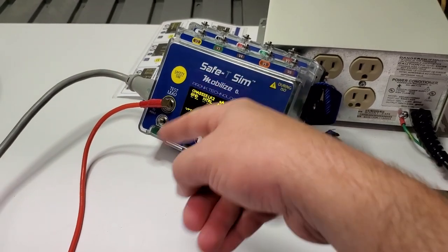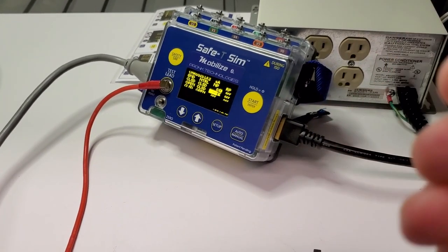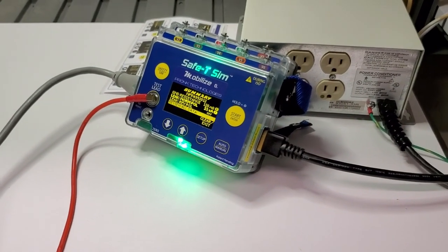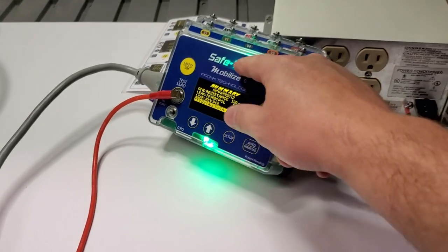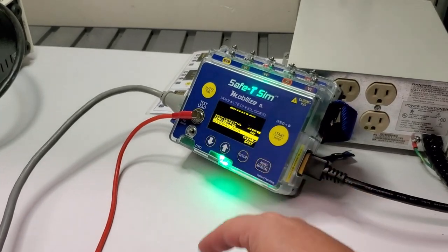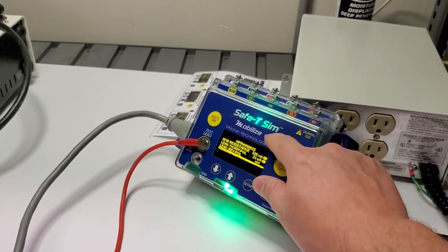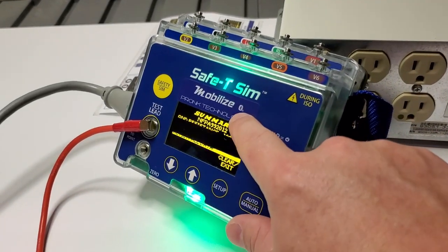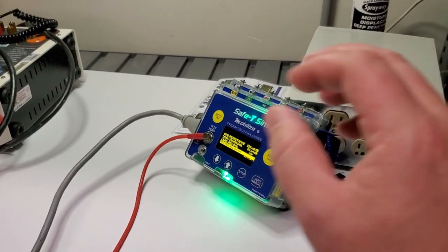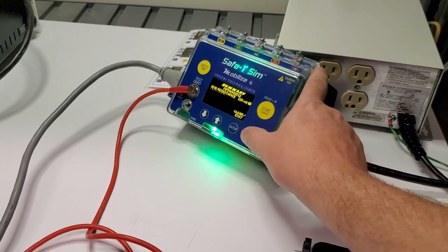The display flickering is due to the frame rate of the camera versus the refresh rate of the display. Here's the final result — it shows you a green light and gives you a brief rundown. You can export all the data, and this particular unit is also Bluetooth-enabled, which works with a Bluetooth app. It does a really good job with that.